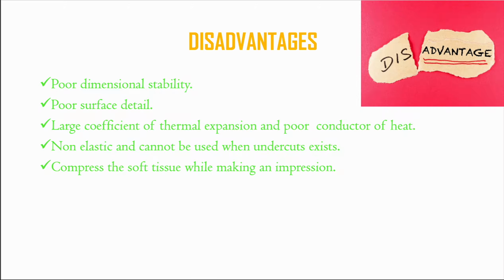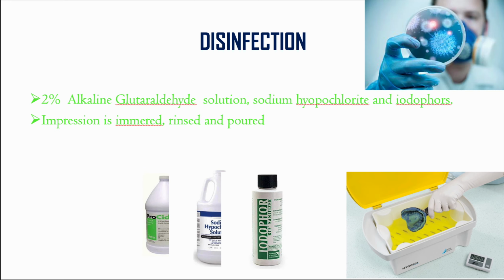Disadvantages include it has poor dimensional stability, poor surface detail, large coefficient of thermal expansion, and is a poor conductor of heat. It is non-elastic and cannot be used where undercuts exist. It compresses the soft tissue while making an impression.